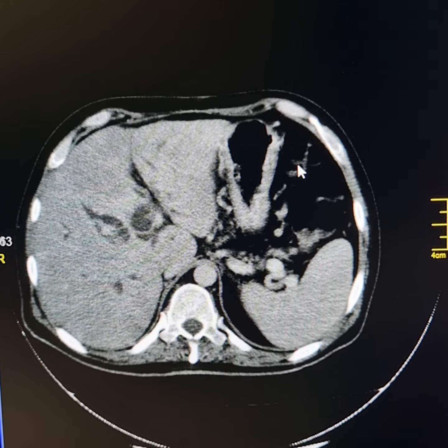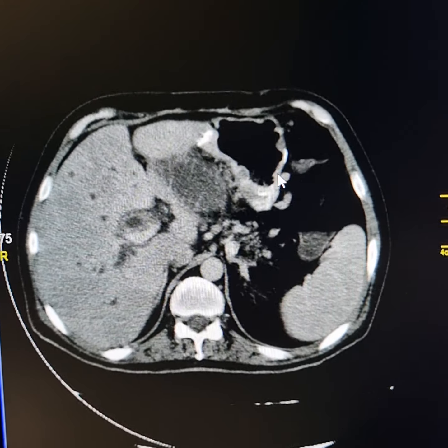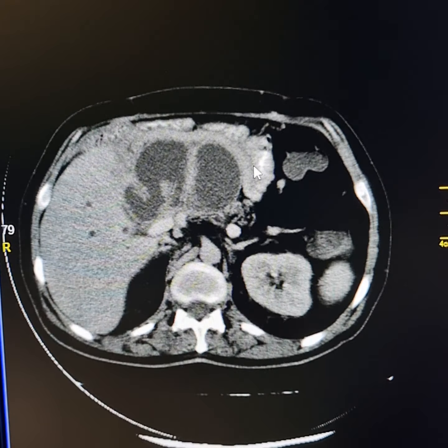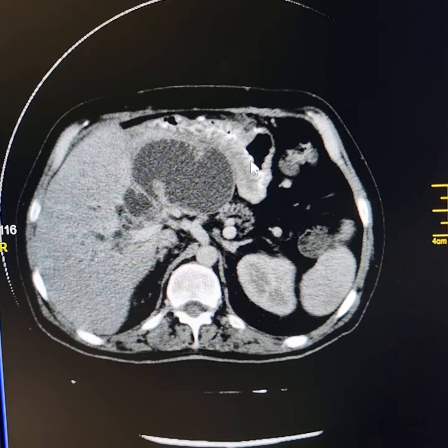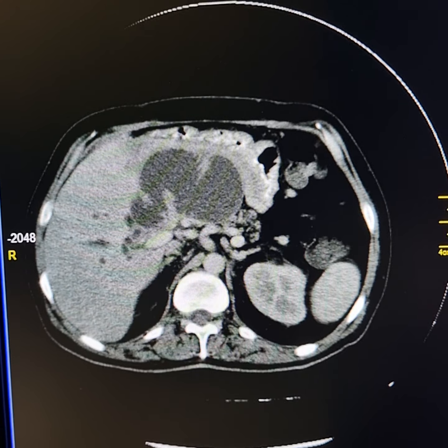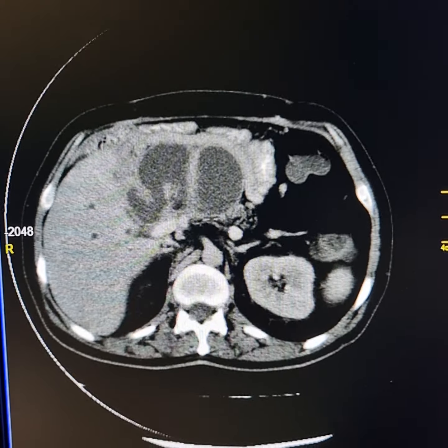Partial gastrectomy and gastrojejunostomy has been done. This is the site of anastomosis, and it is functioning normally. The orally administered contrast medium is passing down into the jejunum.